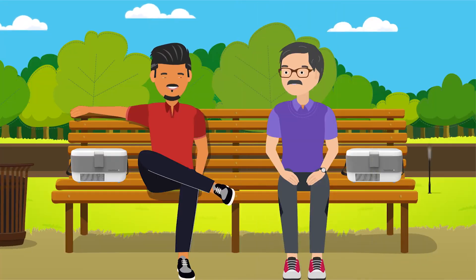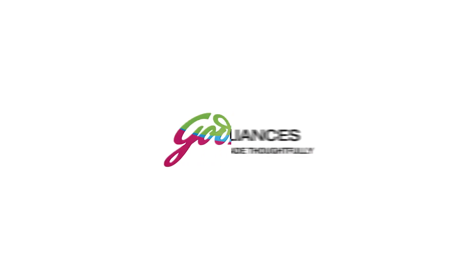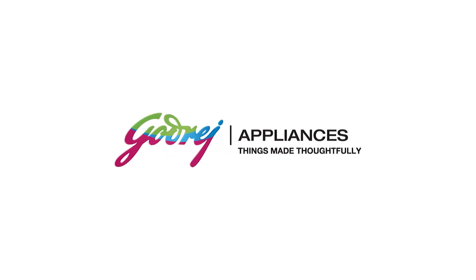All this so that Mr. Sharma and now Mr. Varma can live at ease with diabetes. Godrej Appliances. Things made thoughtfully.